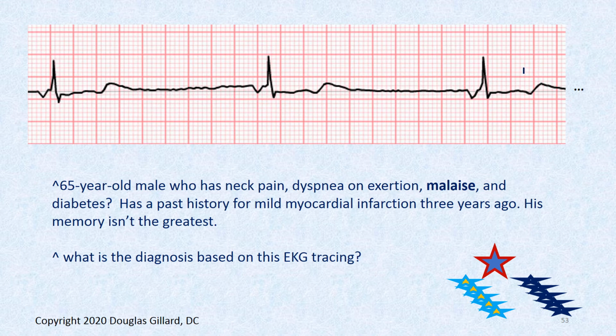I heard somebody say bradycardia. You're right. So that's 300, 150, 100, 75, 60, 50, 43, 37, and down in this area. Once you see it under 37, it's going to be in the 30s somewhere when we use the 1500 millimeter rule. So it's definitely a bradycardia. This is not a sinus rhythm.